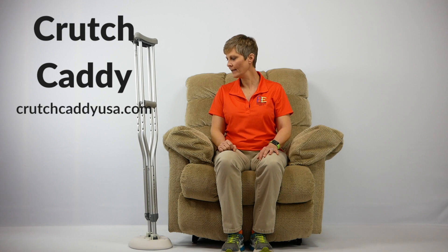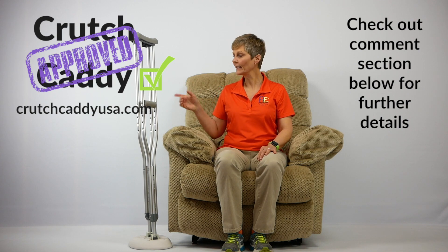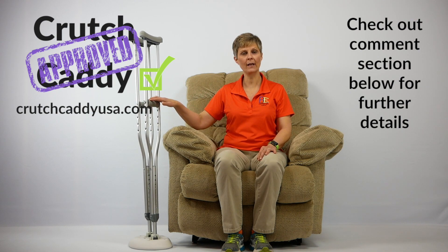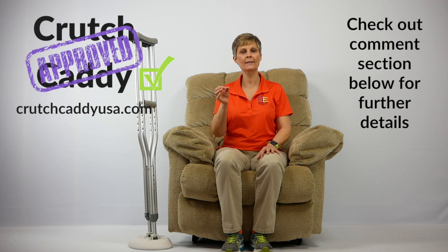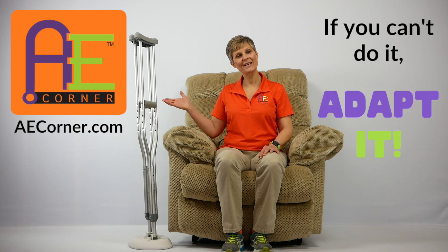So that is the Crutch Caddy. I do really like this product. Be sure to check out the comment section below for further details and a link to where you can find the Crutch Caddy. We will also include the different measurements of the crutch tips as well as the end tubing on the crutches for your information. That's it for today from Adaptive Equipment Corner. Have a great day and don't forget — if you can't do it, adapt it.